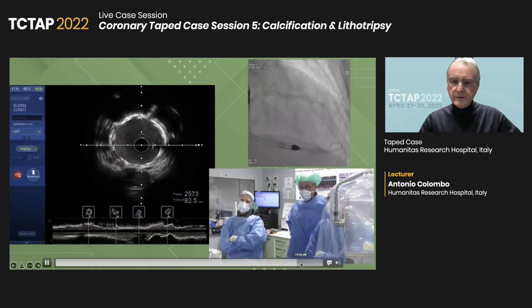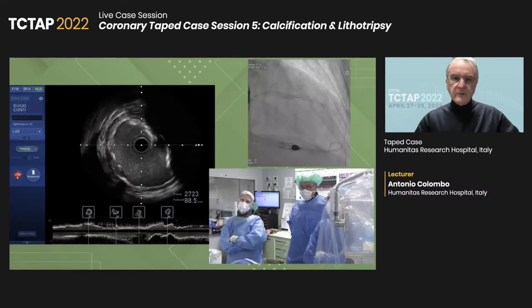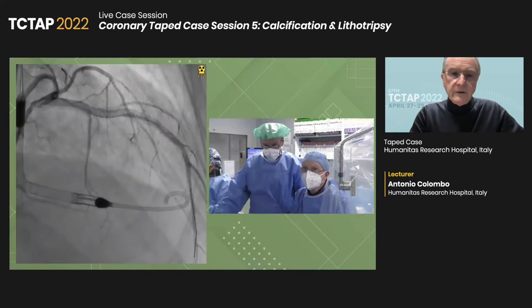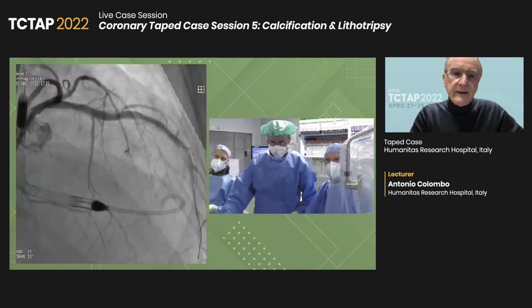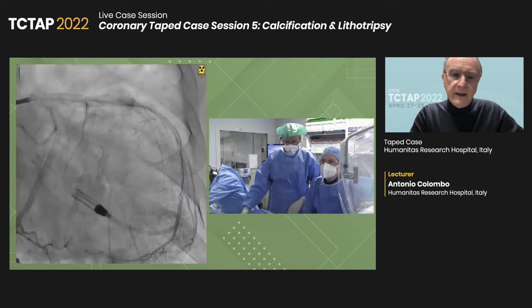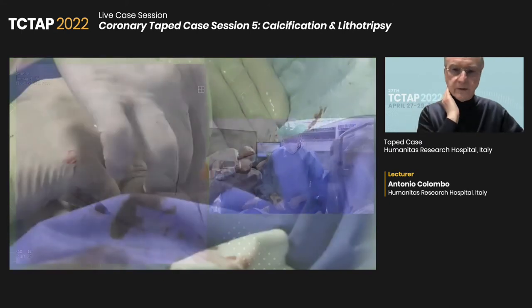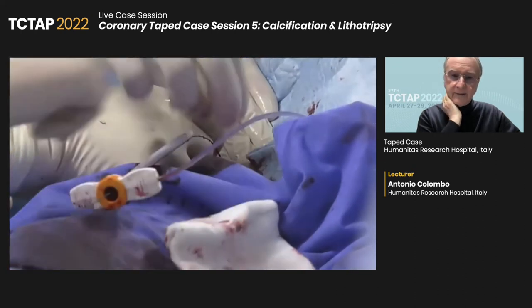Okay, soon we will be doing a final angio. So the impeller was not, in my opinion, a must, but having the luxury, you see the final result, you see how the stent is optimally expanded with a good flow. Despite multiple procedures, dilatation, post-dilatation, preparation, there is no impairment of distal flow. And this is particularly thanks to the impeller system.